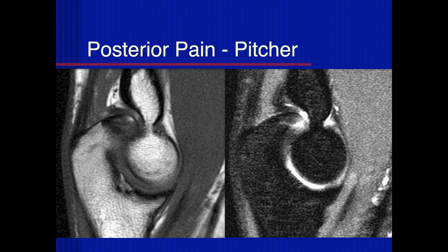So this looks like another fracture of the olecranon, but there is some sclerosis around the margins, so this also looks more chronic to me. This is a fairly common finding that you see in Major League Baseball pitchers, and what happens here is you get chronic repetitive impaction injury to the olecranon tip. You tend to get osteophytes and overgrowth.